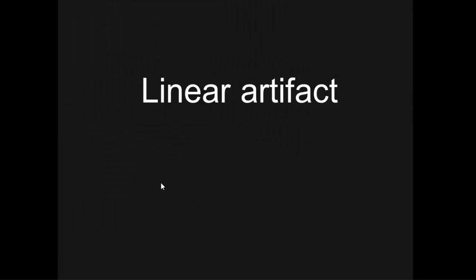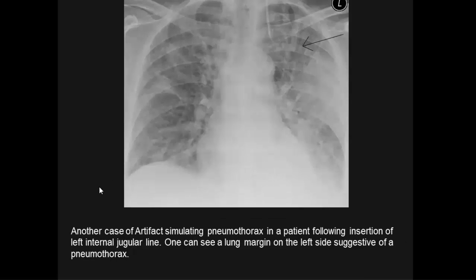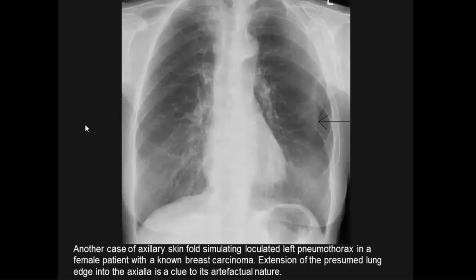Linear artifacts: a curvilinear opacity on the right side with lucent lung lateral to it simulates a pneumothorax, with ill-defined opacification in the right mid and lower and left lower zones — absent on repeat study confirming artifact. Another artifact simulates pneumothorax following insertion of a left internal jugular line, with lung markings visible on the left. An axillary skin fold simulates a loculated left pneumothorax in a female patient with known breast carcinoma; extension of the apparent lung edge into the axillary region confirms its artifactual nature.